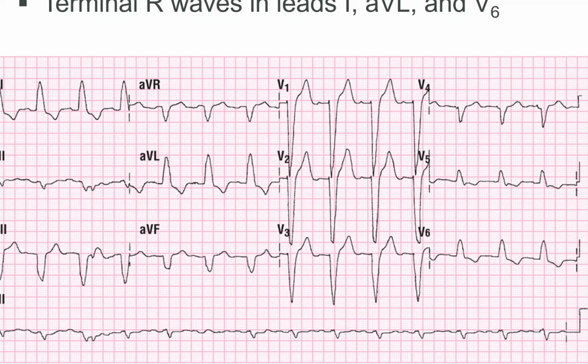Here, actually, you can see these in D1. See those P waves? They're pretty clear there in D1, aren't they? Now that I look at that, I kind of missed that. You got P waves there. So you have P waves. You have this wide, nasty beat that shouldn't be wide and nasty. You're in a bundle branch block. Does that make sense?